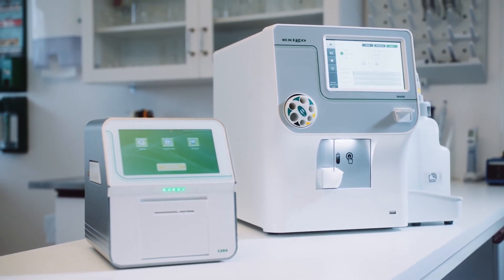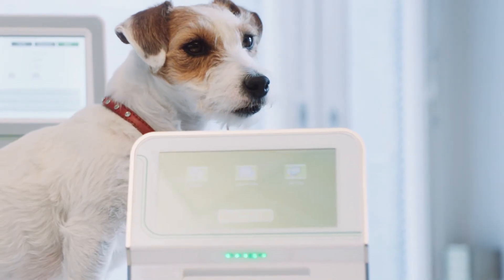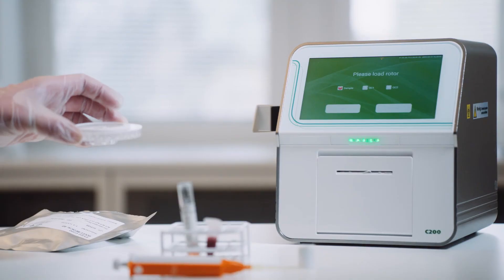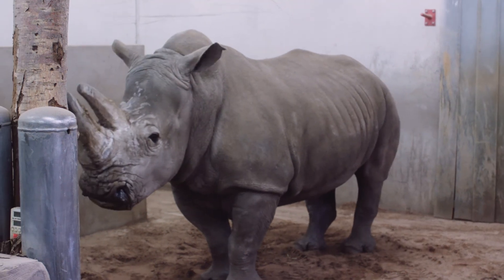Together, the Exigo H400 and the Exigo C200 are a perfect match for a laboratory, providing the parameters clinics require for hematology and clinical chemistry — for small, exotic, and larger animals.